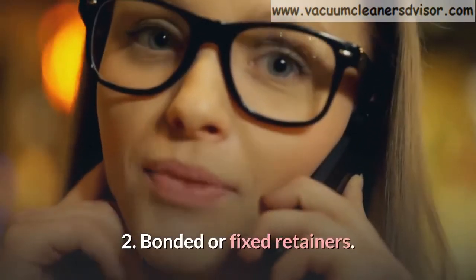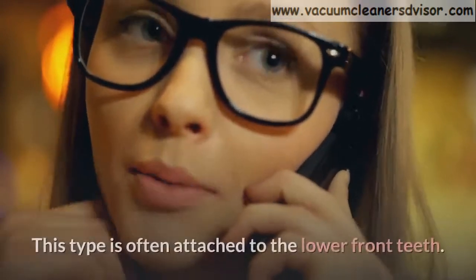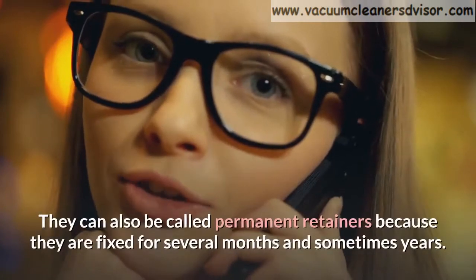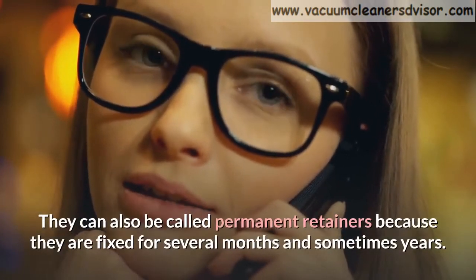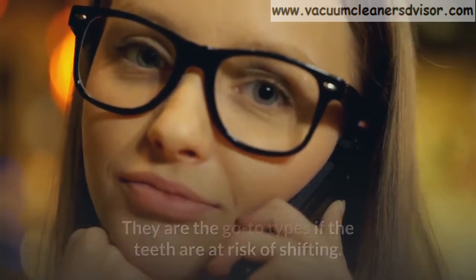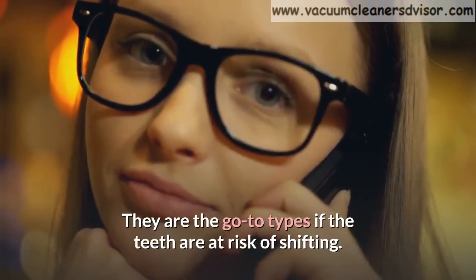Number 2: Bonded or fixed retainers. This type is often attached to the lower front teeth. They can also be called permanent retainers because they are fixed for several months and sometimes years. They are the go-to types if the teeth are at risk of shifting.